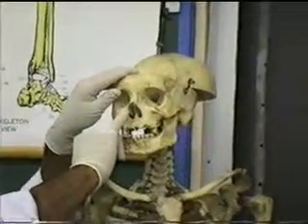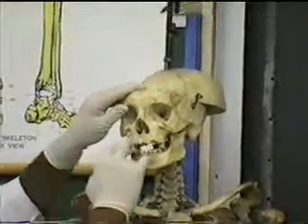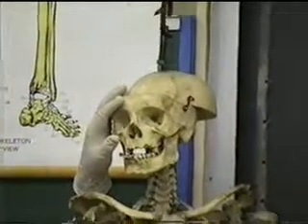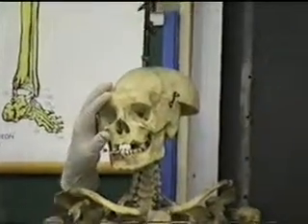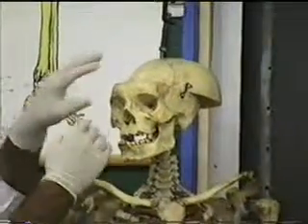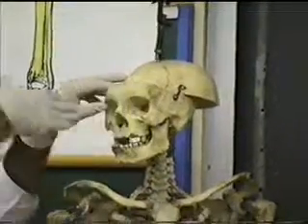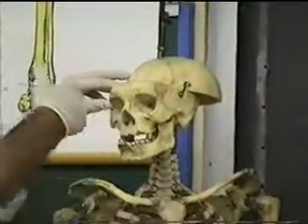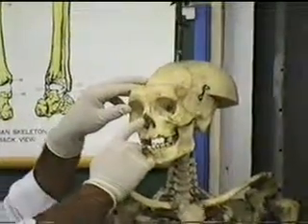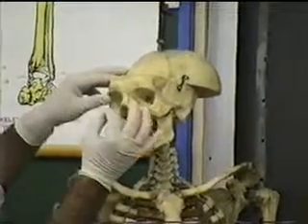It's very important, and it's most easily seen on a skull like this, that you engage it at a right angle to the bone. Now the bone comes inward and upward. When a patient is lying on the table, the piriform aperture comes in and up this way, so that when I put the osteotome in to get it at right angles, I don't come like this, but I will come down and outward.